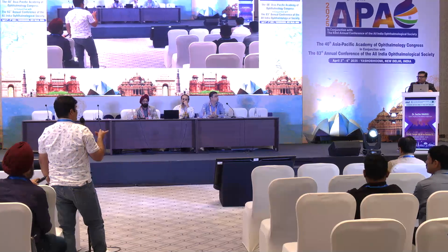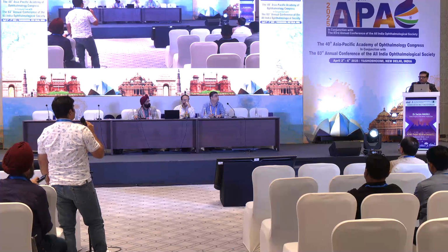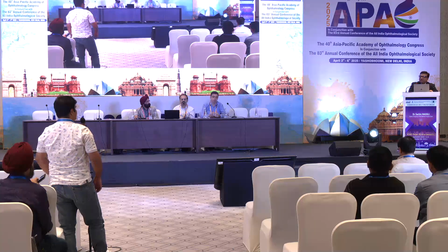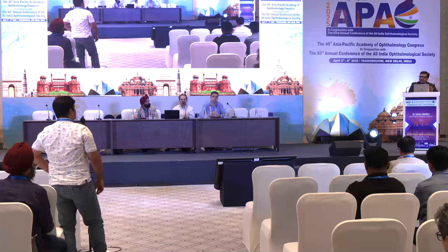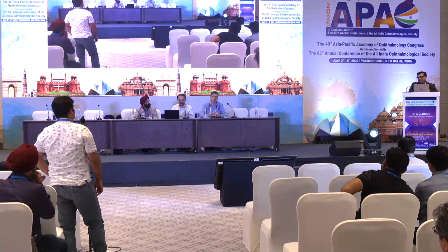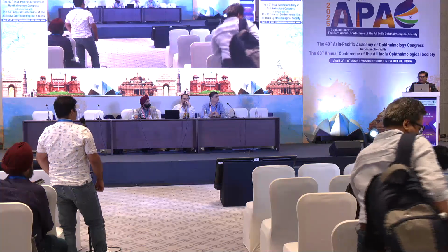So for biometry, what will be the difference in the IOL power? Most of these biometers come with the silicone oil mode in place. So these formulas work. You should always get the other eye done in all these combined cases and rely on the pre-operative refraction the patient had, especially if you are dealing with diabetics, because a few times you have a refractive surprise when you do combined surgery.